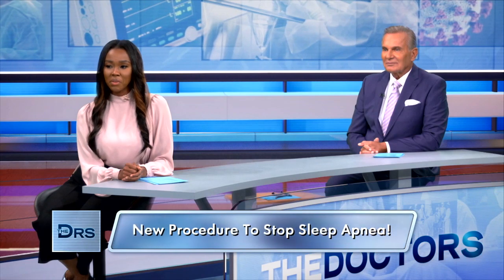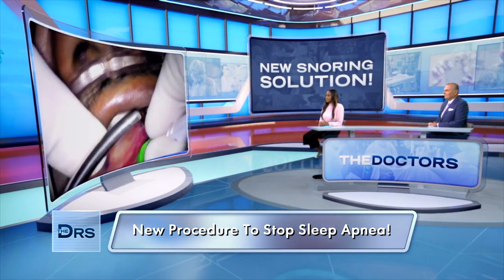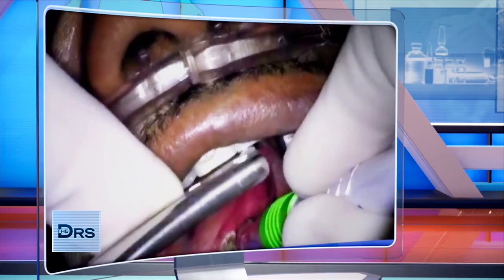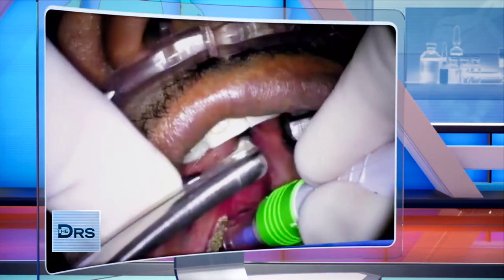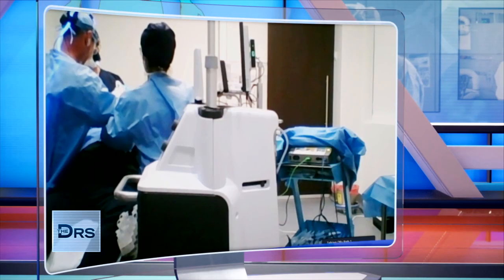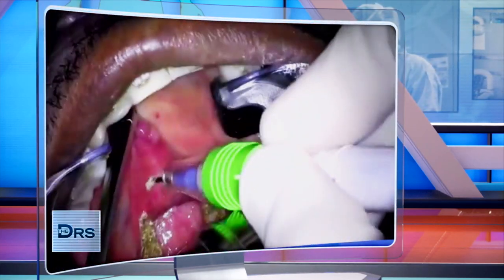What kind of anesthesia are you working with? We're using intravenous anesthesia, so I have my anesthesiologist, and he's par excellence. He is giving some intravenous sedation, the same type of sedation that you would see when you were doing a colonoscopy or that type of thing. So instant on, instant off intravenous anesthesia. So you can see I'm now going to make an incision in this uvula.